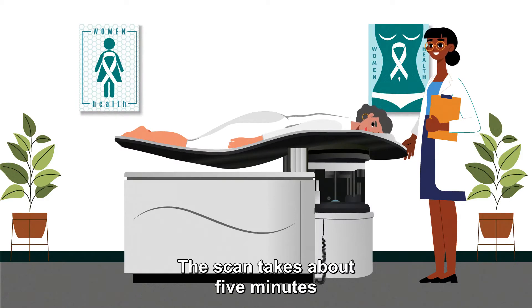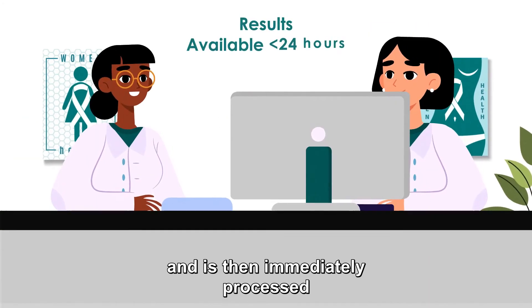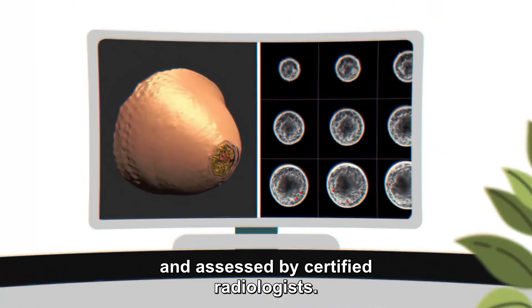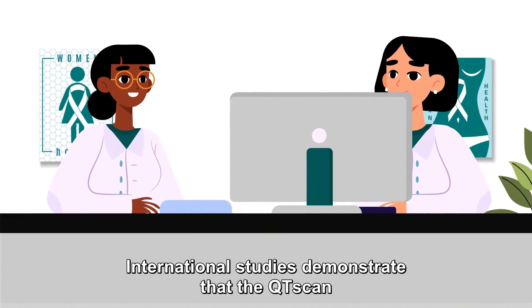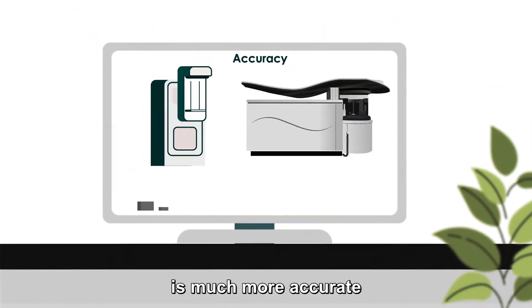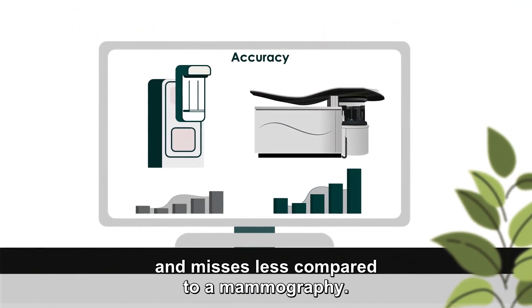The scan takes about five minutes and is then immediately processed and assessed by certified radiologists. International studies demonstrate that the QT Scan is much more accurate and misses less compared to a mammography.